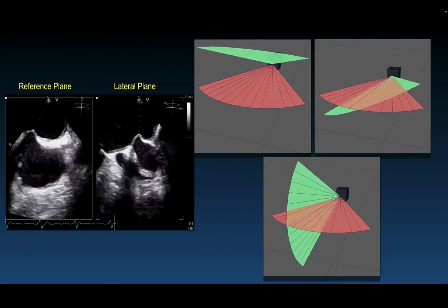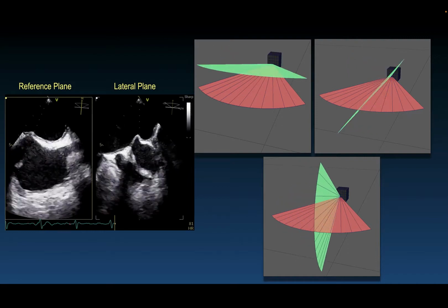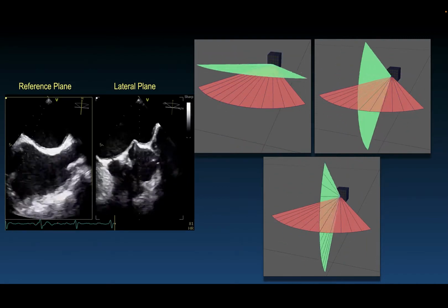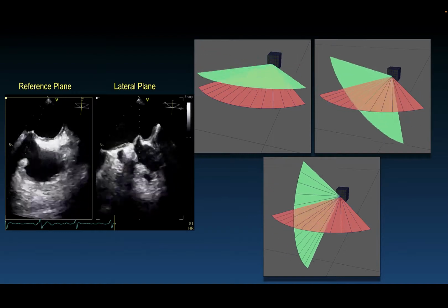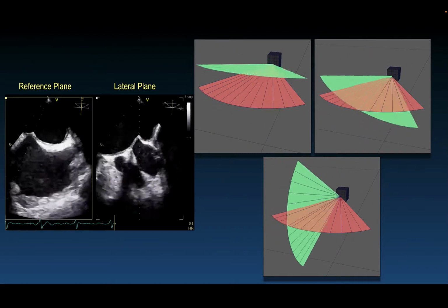But sometimes you don't get it. For example, in this patient, during the practice phase, we figured out that the simultaneous orthogonal plane imaging was not very good and wouldn't demonstrate this. So we did not use it. This comes into the practice phase: if you can get it in the practice phase, simultaneous orthogonal plane imaging is good. But if you don't, then don't waste time doing this.